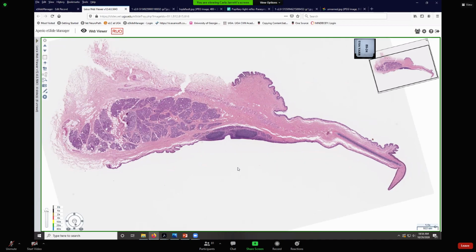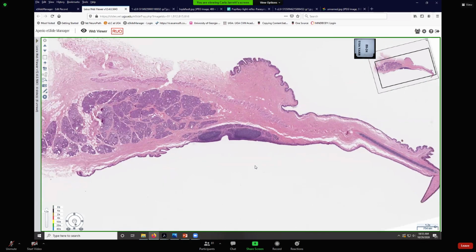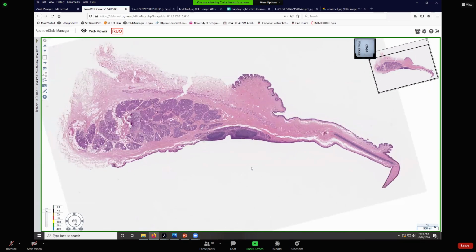So you need to know the basics of it, because you're probably going to hear about it a lot in your ophthalmology course. It's a fold of conjunctiva, and it's called so many names. The third eyelid, the palpebra tertia, tertia meaning third, eyelid is a palpebra. The nictitating membrane, the haw. There's some other things that they listed that I'd never heard of. But it's important in domestic species.